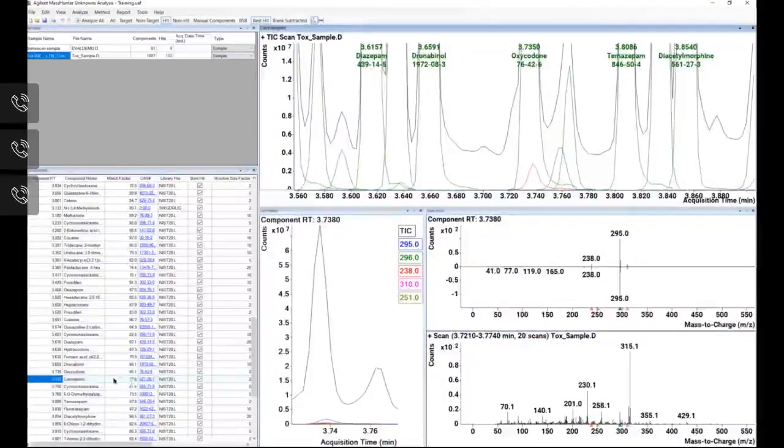And again, it's whether or not you want to run a sample and match retention times and everything else and extract whether it's worth it or not. But maybe this isn't cannabinol, maybe it's fentanyl or one of the fentanyl analogs under quinine or something like that that you would need to see. And so this is our deconvoluted spectra. This is our library spectra. This is our raw spectra.